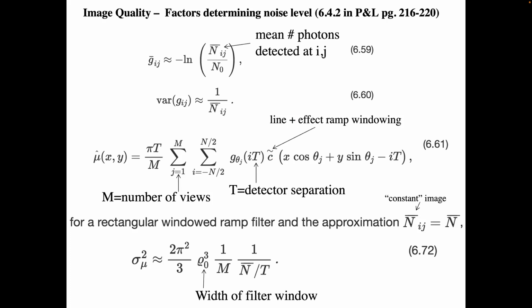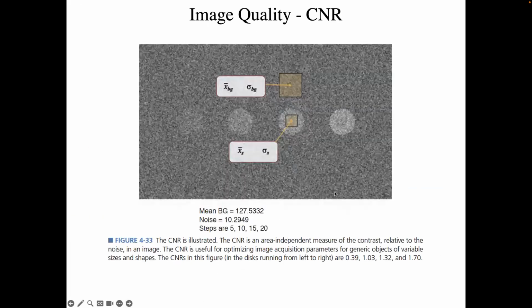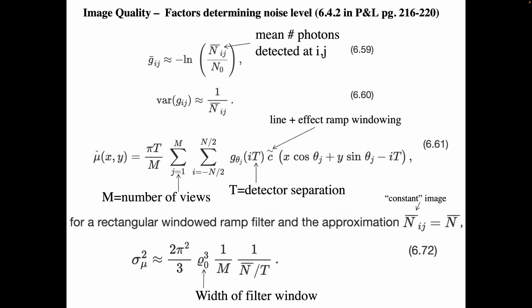Every image has oscillations in amplitudes, otherwise there's nothing to look at, right? But what we're going to do is, if we go back to this example here, in the background here, there isn't a heck of a lot of detail, but we do have a signal level, we do have a noise level, and we're computing what that noise level is as a function of changing parameters.